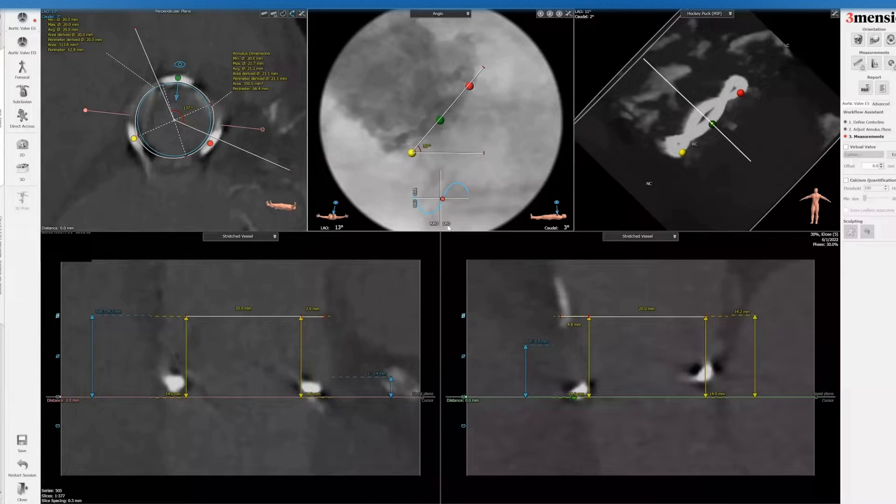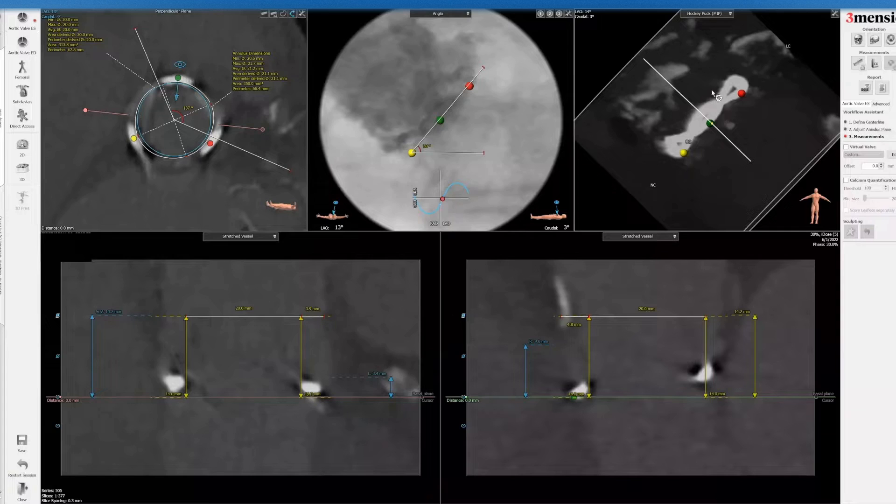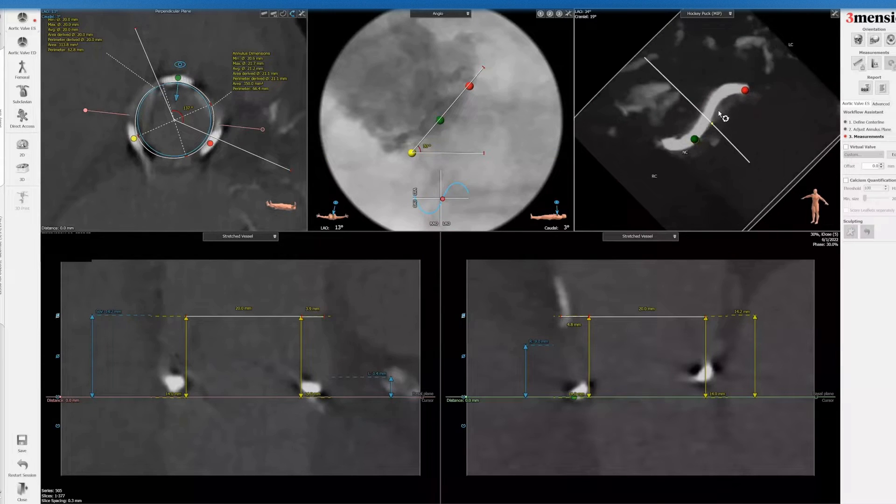This is the LAO cranial view, which is why you need to do a semi-selective or pigtail shot on this view to assess left main obstruction risk. Remember the leaflets don't go all the way to the edge — they're actually set inside the edge a little — but the externally mounted leaflets would appear to extend further. The room may actually be roomier than expected, though with a balloon expandable valve you might deflect the leaflets more outward and still have left main obstruction.